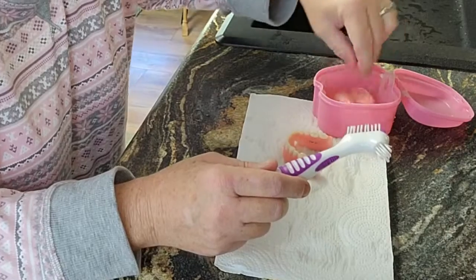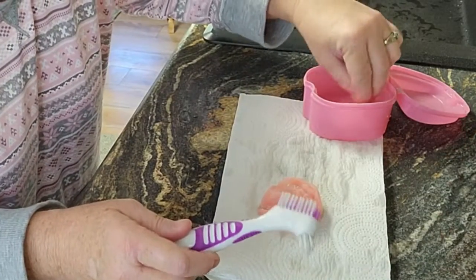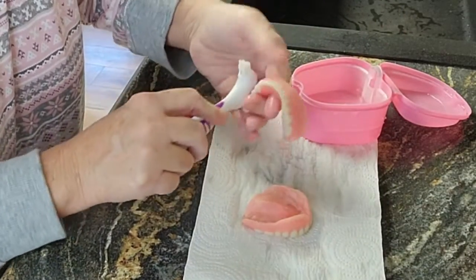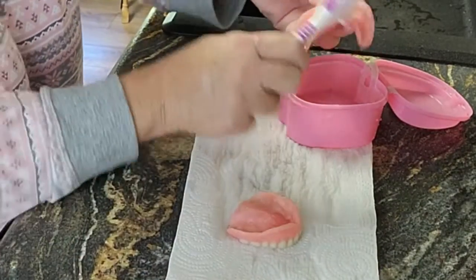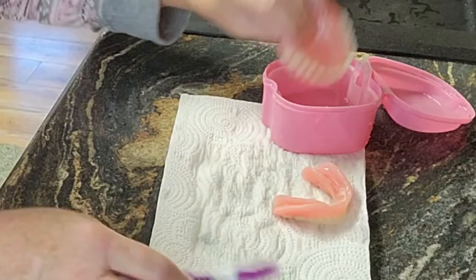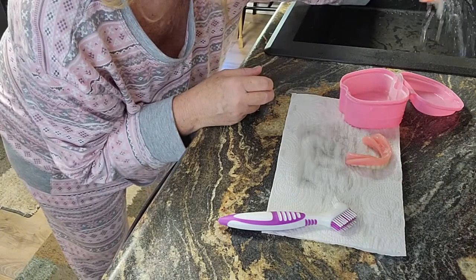You can even let it soak — it's not going to hurt your denture. Let's get the other one in there. We're just going to rub that around; you can even do the inside, it's not going to hurt anything. Let's see what it looks like. I'm going to rinse them because I don't want to have the taste of vinegar in my mouth all day.